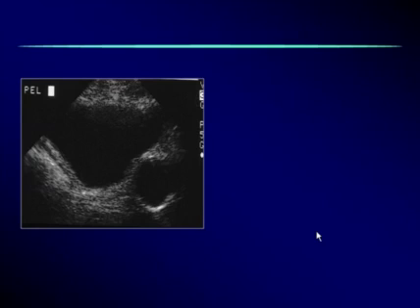Another thing that's important to remember in scanning anywhere in the body is if there is a cystic structure and it does not really meet criteria of a cyst, or it looks a bit odd, always turn on the color Doppler. So here, this postmenopausal lady, here's her bladder, and in the left adnexa, there was a cystic mass. Now, if you're not careful, you may pass this off as some kind of ovarian cystic mass. Does she need surgery? But something's not right about it.